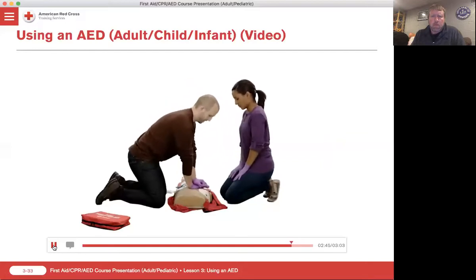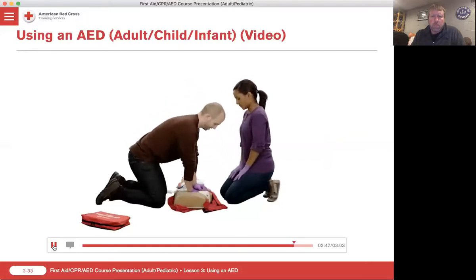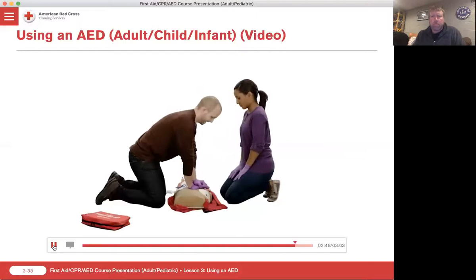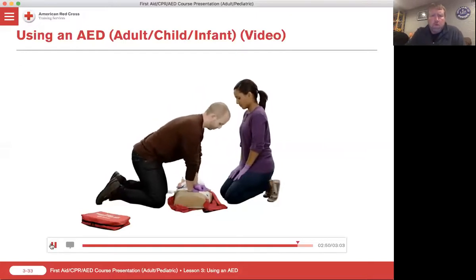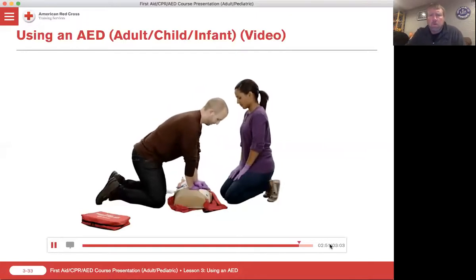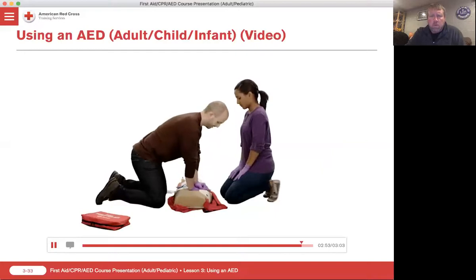Notice how CPR and AED use are working together as parts of the cardiac chain of survival. When CPR is not interrupted to prepare the AED, chances of survival are increased.